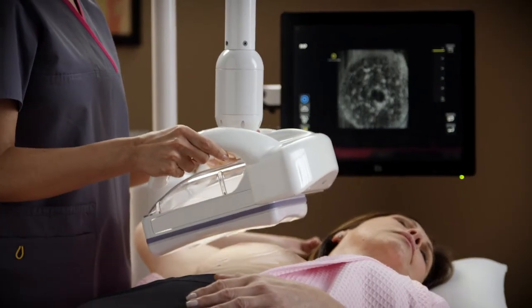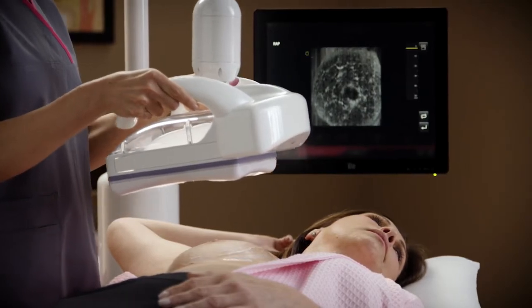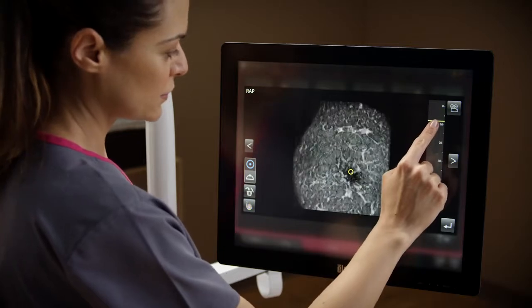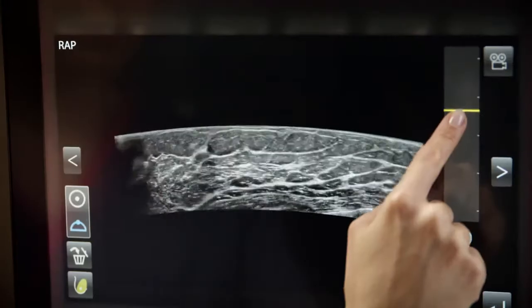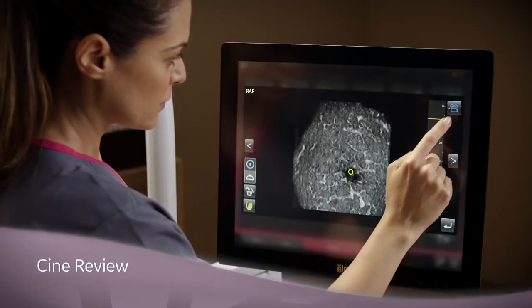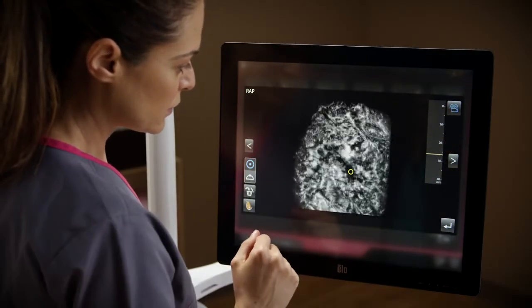After the acquisition is complete, a coronal view is displayed. The operator marks the nipple and performs a quality assessment review using either coronal or transverse data. The cine review function can also be used to automate the review.